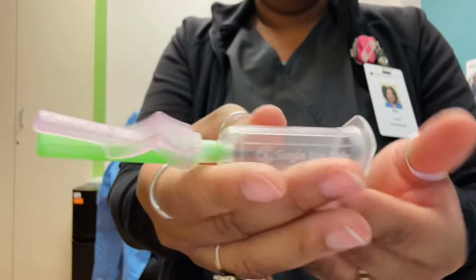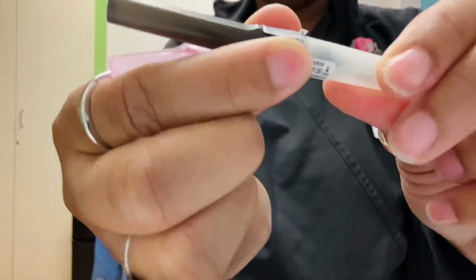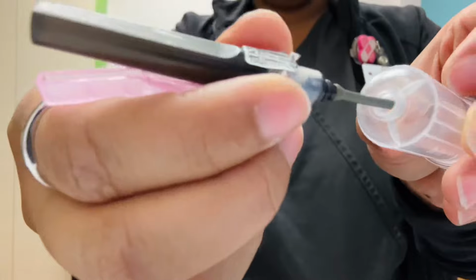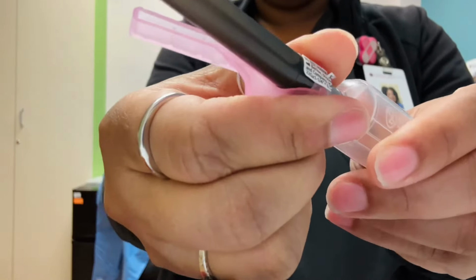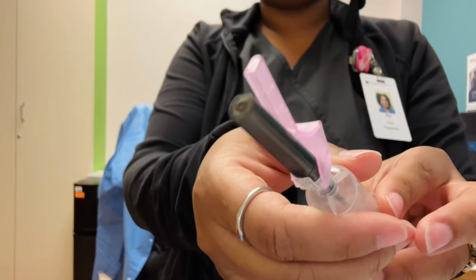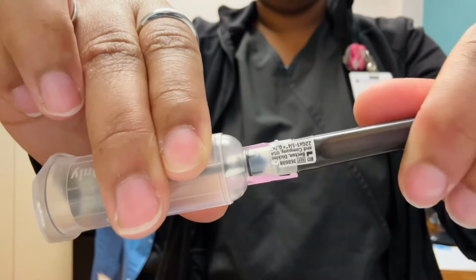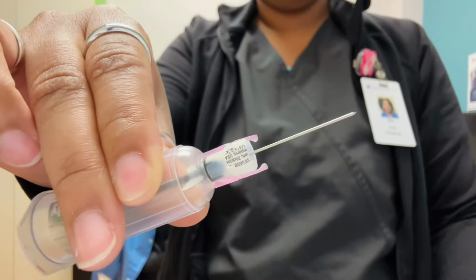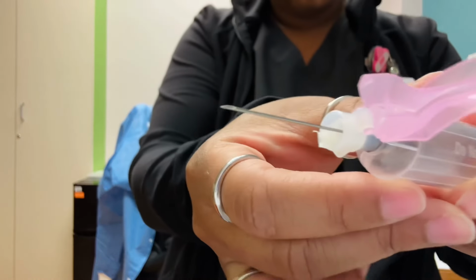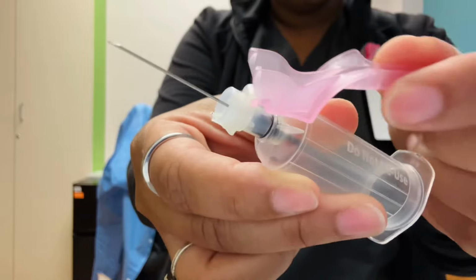And like I said before, it just depends on where you're working and where they get their supplies from. You may have some needles that have the safety on it, or you may just have the needles that don't and you have the hubcaps with the safety on it, just depending on where you work and how they order. So now when using these certain needles, you are going to lift the safety lever towards you, and then you can remove the cap from the needle to expose the needle. And you can see here that our bevel is already naturally up when it comes to these needles. I love that because, like I said, it's just boom, bam, boom, and you're getting ready to get started.